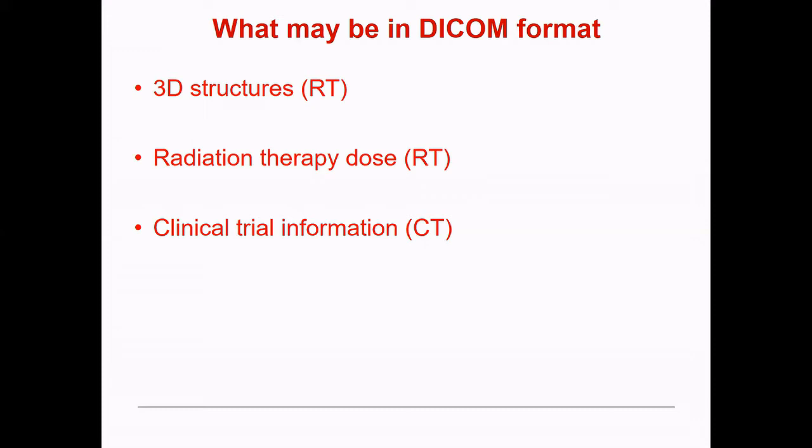And then what may also be worth noting is that there are some open source picture archive systems like Orthanc or Osiris in some sense also, that help you store and read out the images at the same time. But basically, if you go online, you will find many tools for both reading the DICOM header and reading DICOM images. It's really a standard that has been around for a long time, so that both for academic and non-academic use, there's a lot of open source software available.